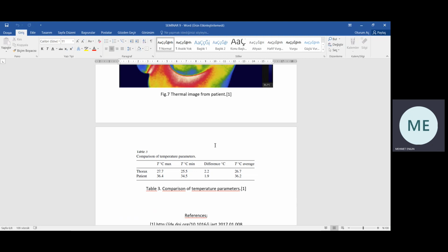To equilibrate thorax temperatures with human ones, it is proposed to homologate the local temperature observed by the thermal camera from the virtual instrument in LabVIEW. This is accomplished by adding to these measurements a scale factor of about 8.7 degrees Celsius, so that the temperatures observed in the programmable thorax through the virtual instruments correspond to human body temperatures.